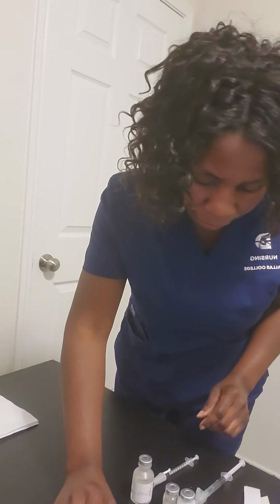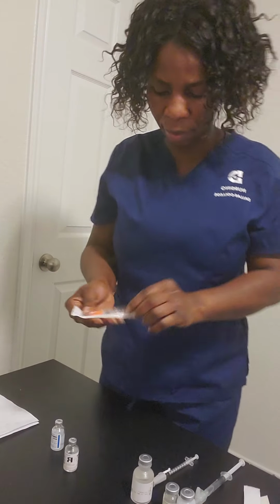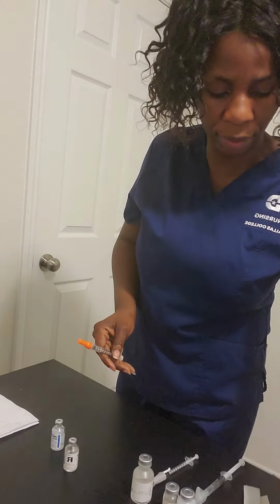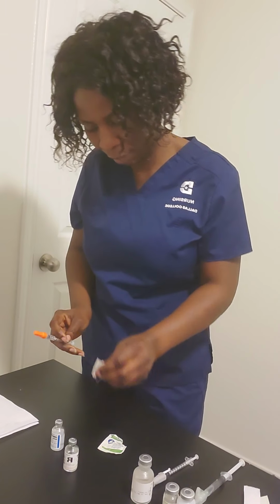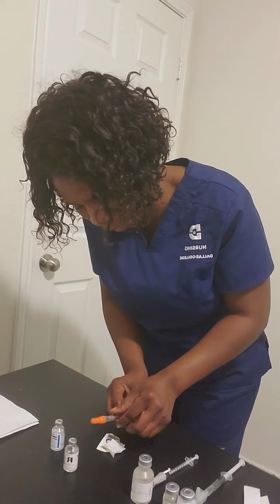Then the next medication is NPH insulin and the regular insulin. I'll take off the cap. Then I'll be using another alcohol pad to clean the top of the vial. But before I clean, I have a cloudy insulin. I'm going to roll that in my hand.